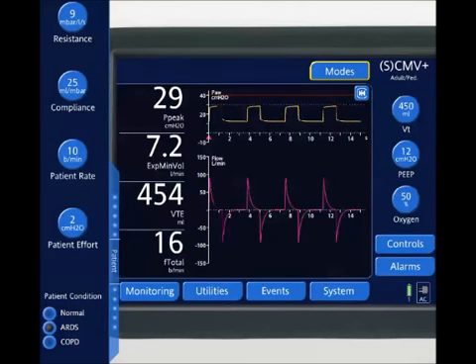All right, this is my ventilator simulator, and I have it set up for that patient that's in ARDS. As you notice on the left-hand side of the screen, I have it set for an ARDS patient. I'm going to show what happens if we want to target a tidal volume. In volume control, we're going to have flow asynchronies, flow mismatch. In pressure control, they're going to get all the flow they want. However, their tidal volumes go up dramatically. So, well, let's just use adaptive pressure control.